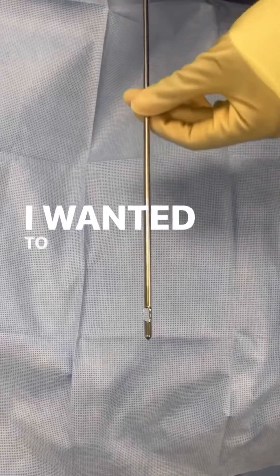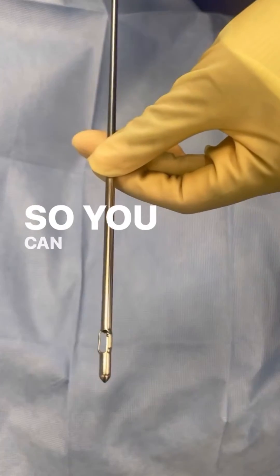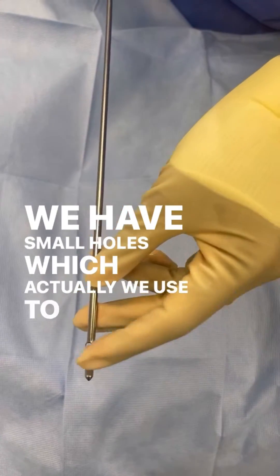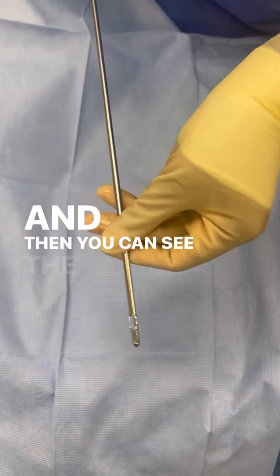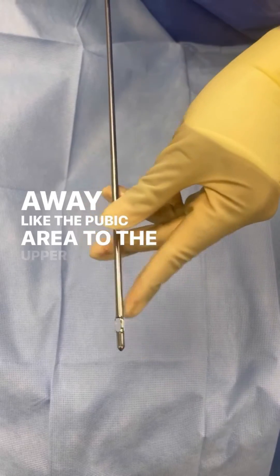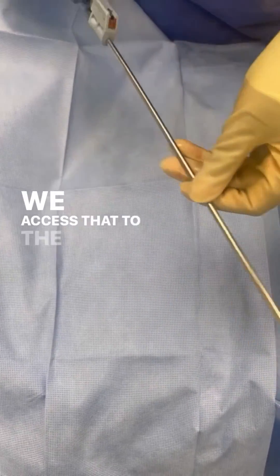Hey everyone, it's Dr. Amok. I want to show y'all a liposuction cannula. You can see the liposuction cannula there. We have small holes, which we use to suck out the fat. And then you can see the tube is really long. Why is it so long? Because we often access far sites away, like the pubic area to the upper abdomen. And that's how we access that with the long tube.